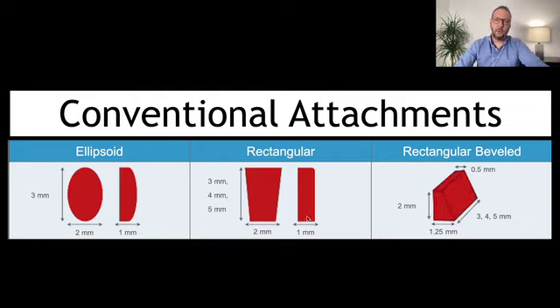And the one that I like more, okay, is the rectangular beveled with this angle here. So we have this big inclined surface, and then we can select the side we want to incline, depending on the force, okay? This is very useful for us, and I'm going to explain why it's better to use this model than this model for most situations, okay?